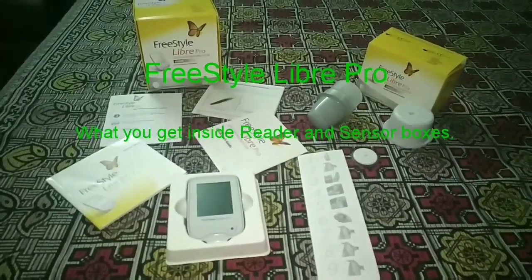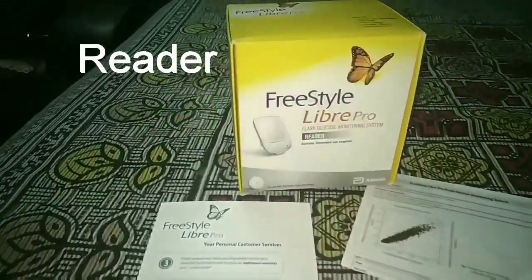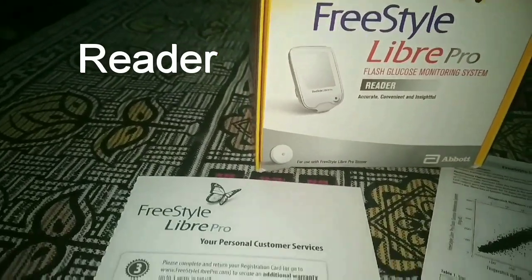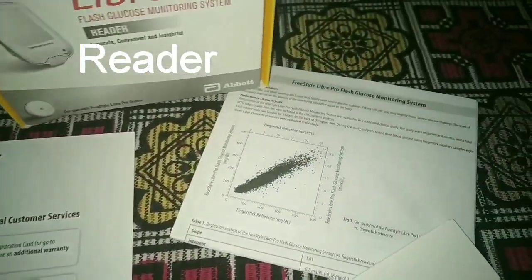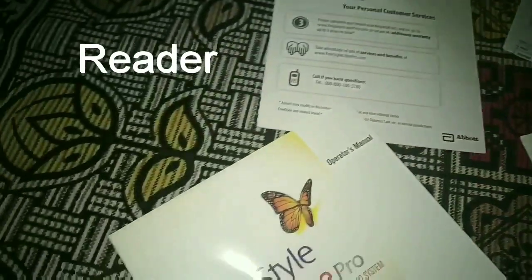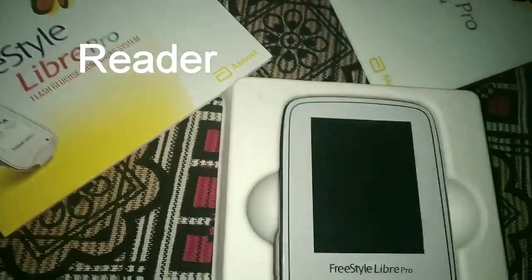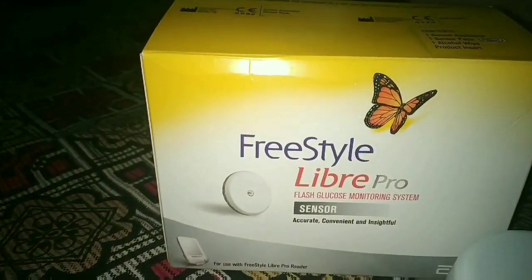Freestyle Libre Pro — let's see what's inside. This is the reader box containing a reader and a sensor box. Inside the reader box: a customer service and warranty card, a manual describing how it works, a quick start guide, an operator manual, and the actual reader which reads the sensor data.